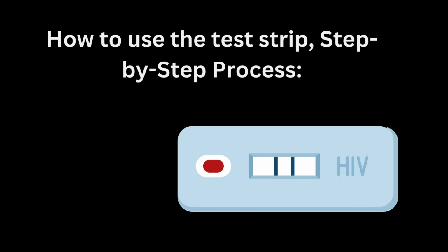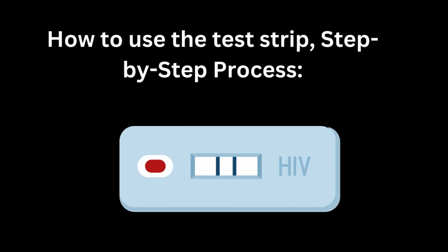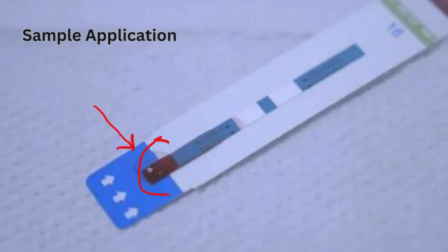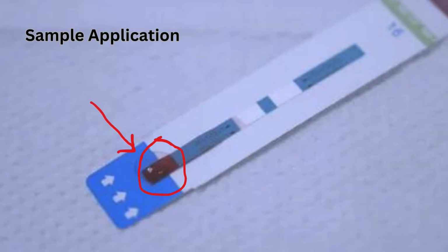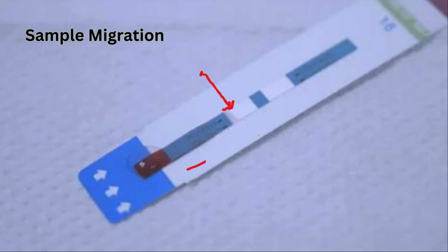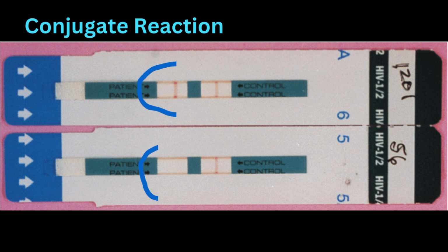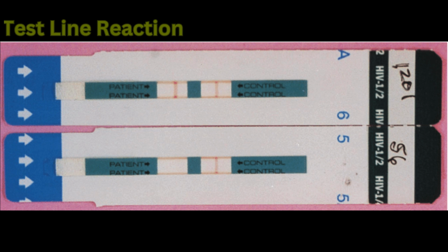How to use the test strip step-by-step process. 1. Sample application. Here, the user applies a small amount of the specimen to the sample pad. 2. Sample migration. In this compartment, the liquid sample moves along the strip by capillary action. 3. Conjugate reaction. As the sample reaches the conjugate pad, any HIV antibodies present in the sample bind to the labeled HIV antigens.